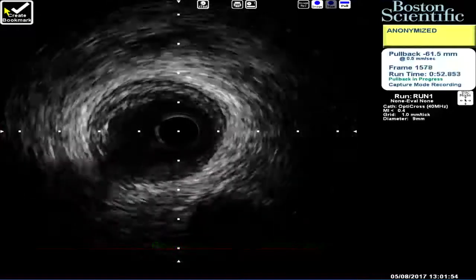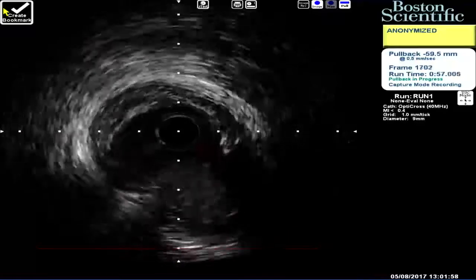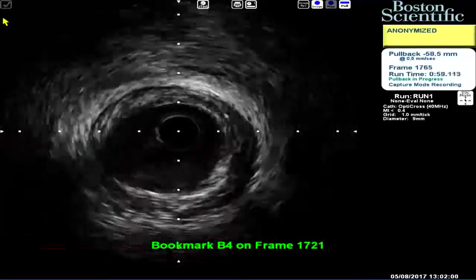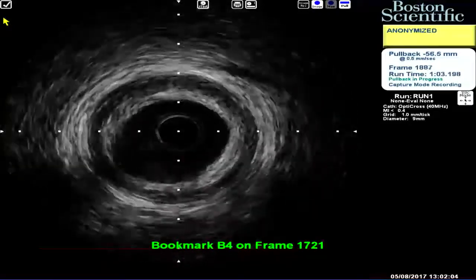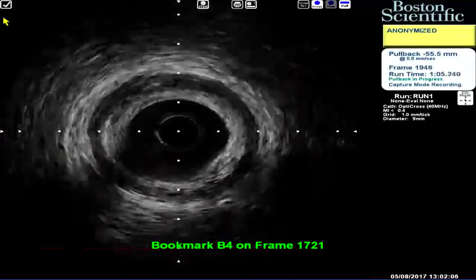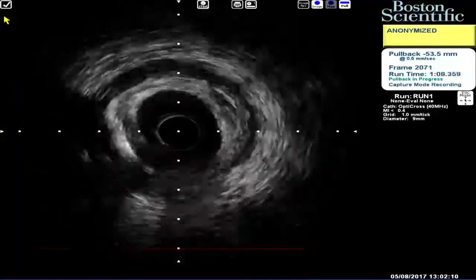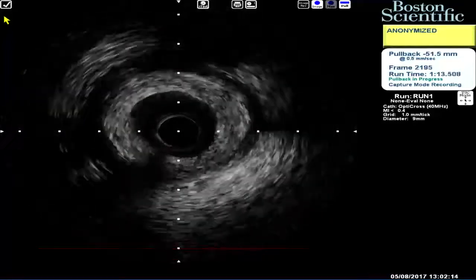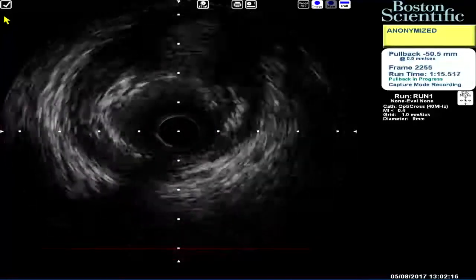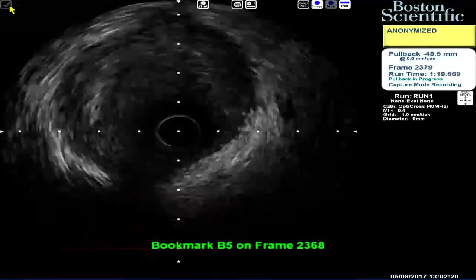And then that is the diagonal and septal we saw. So proximally it's larger than 3. Proximal is definitely much larger than 3. Now look at this. Even there is a lot of atheroma in the artery where it looks okay angiographically. We can stop it.